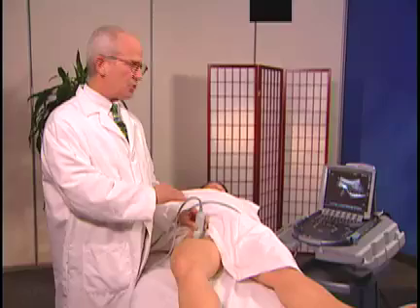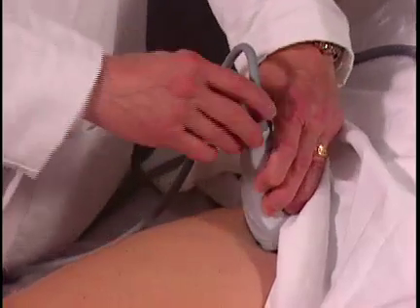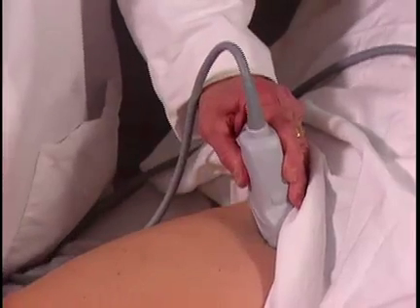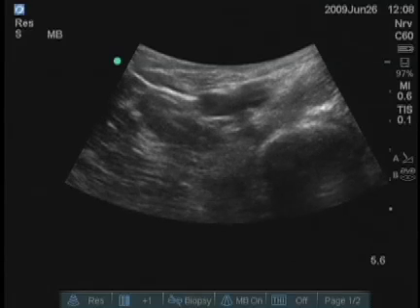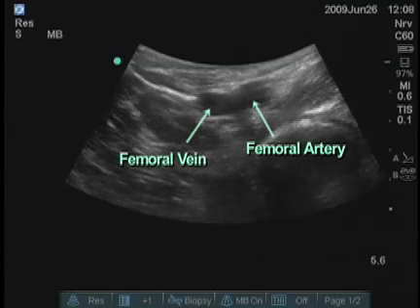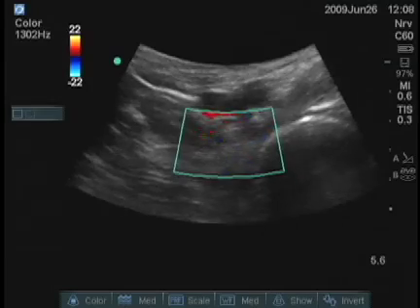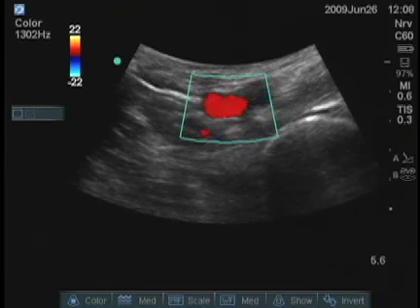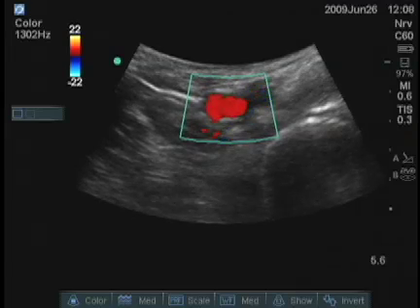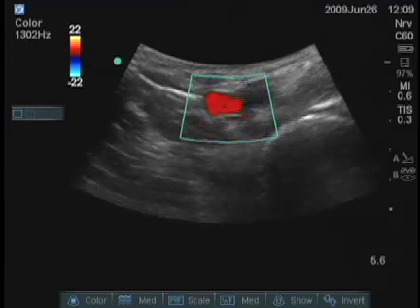Before you do anything, you want to identify the great vessels. I will turn the transducer transversely and look medially, and we can see the anechoic structures that are pulsating. I'll turn on the color to confirm that those are the vessels. We want to obviously avoid those.